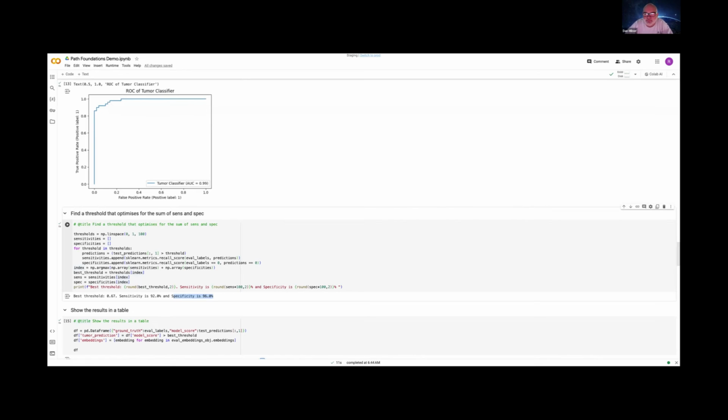How would that work? Absolutely, great question. And there's a couple ways to do this. The way I would do it, which is maybe a little less exciting, but hopefully easy to understand, is I'd actually build a separate lung classifier, breast classifier, cervical classifier, prostate classifier. So you'd have these linear probes, because they're very cheap to run. As we said, it's a very simple operation. You can train, like you put all your prostate patches in there and say, this is a positive label now, and then all my other stuff is a negative label. So it learns to distinguish prostate versus not prostate. And you do the same for lung, you do the same for breast.